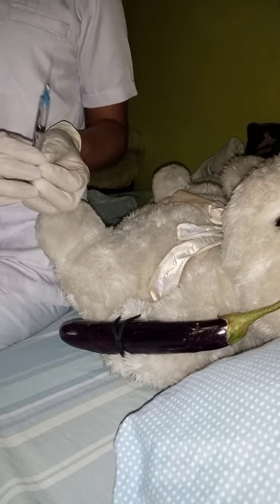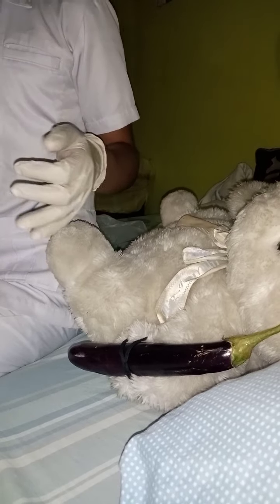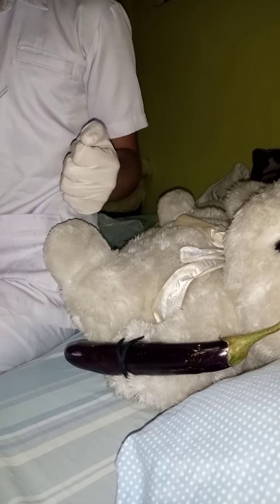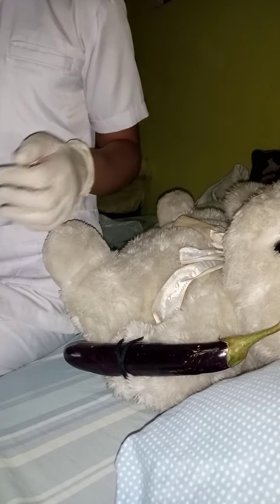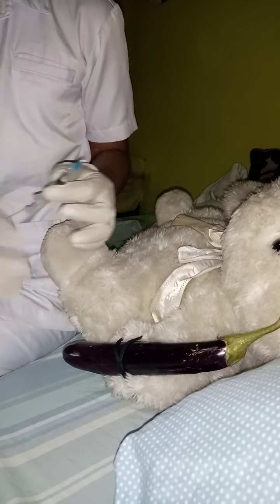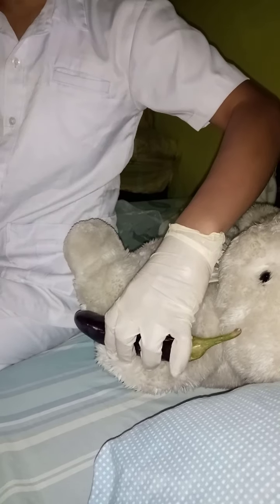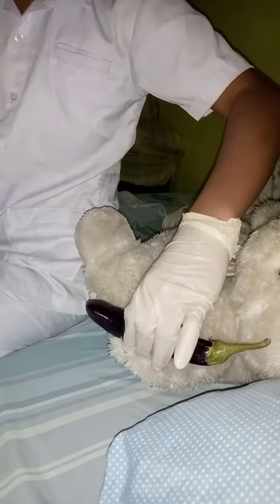So now grasp the syringe in your dominant hand close to the hub, holding it between thumb and finger. Hold the needle almost parallel to the skin, with the bevel of the needle up. And after that, with the non-dominant hand, pinch the skin of the patient and pull the skin at the site until it is taut.